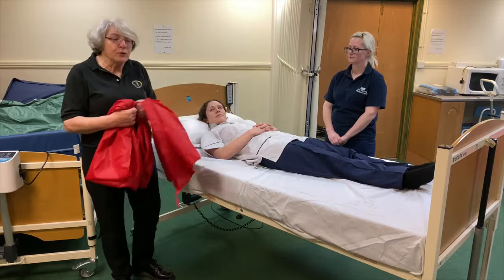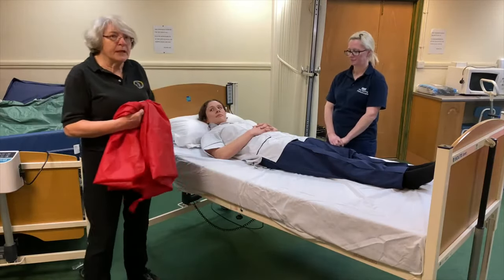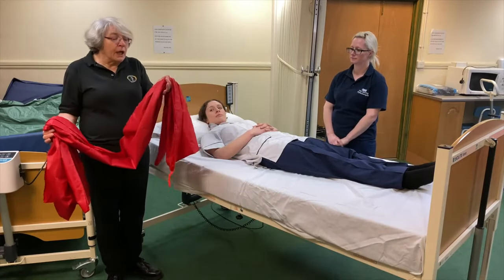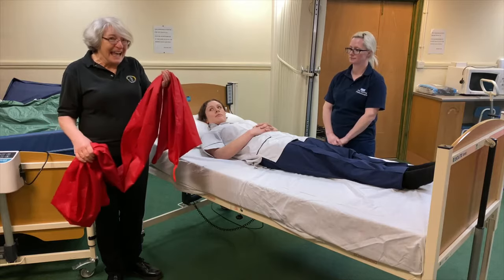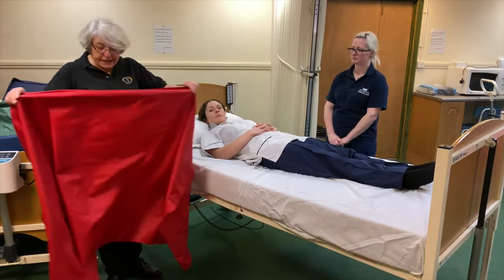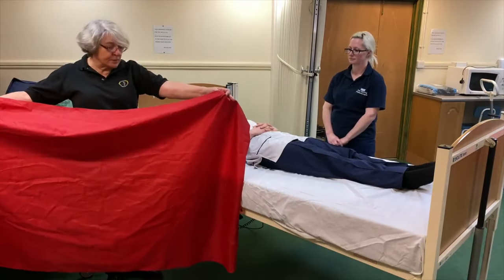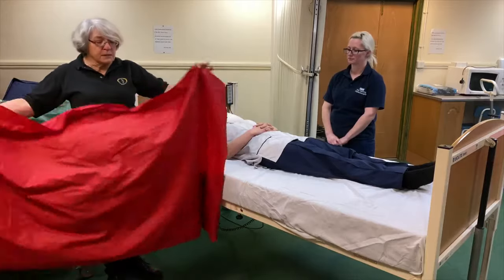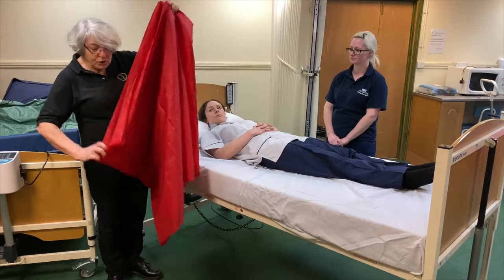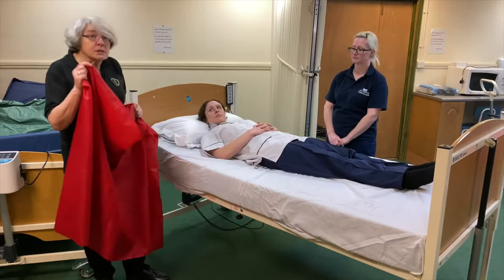And to leave her in what we will call the 30-degree tilt, then we need to bring her to the middle of the bed. And we need to use a slide sheet. Now, in the hospitals, there are different length slide sheets. This is a full length slide sheet. There are more of these in the hospitals. Some of the hospitals that only have, say, a 3/4 glide sheet will not encompass the whole of the person's body, so you must use two.